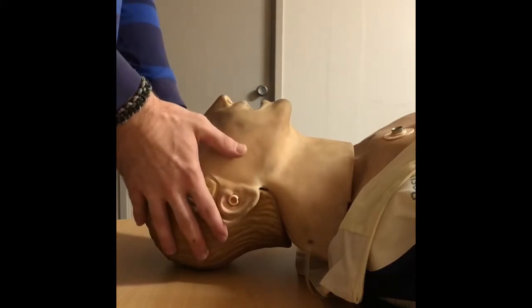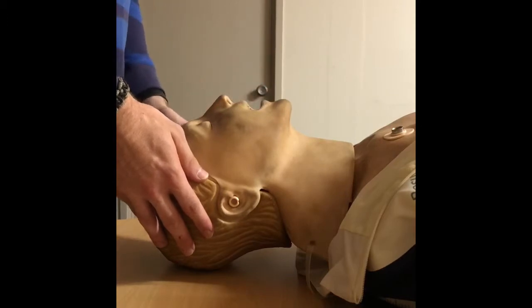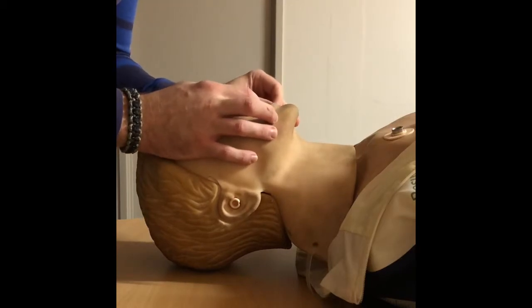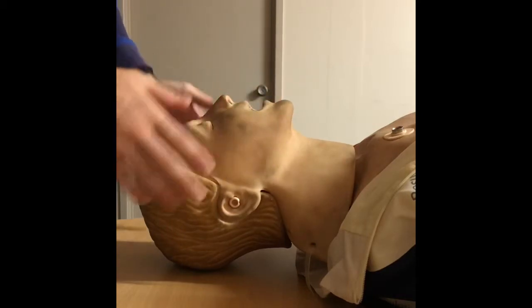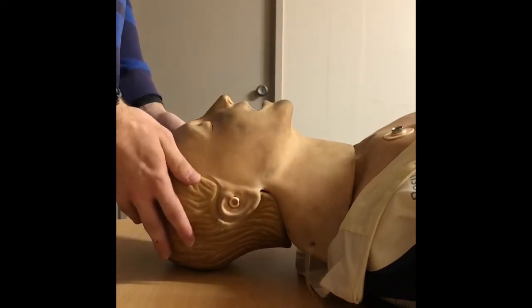Moving on to M, the Mallampati score. This mannequin does have a defective tongue, which does impact our assessment here. However, I can see the tonsillar pillars, the uvula, soft palate and hard palate, giving us a score of 1 because the tongue is defective and has fallen backwards. Now we can look for obstruction and look for the history from the family as well.